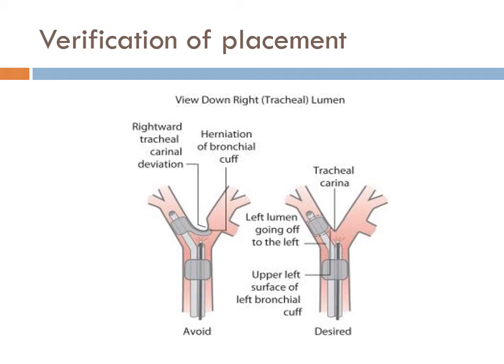So I'm ventilating and I notice a change in compliance, because we typically ventilate pediatric patients in pressure control settings. One, it eliminates the chance that you accidentally put them on the normal backup of like 10, 500, which is the adult setting, and you cause volume trauma, right? And two, I don't remember what two is, but that's probably one of the main reasons. So we usually do pressure control settings.